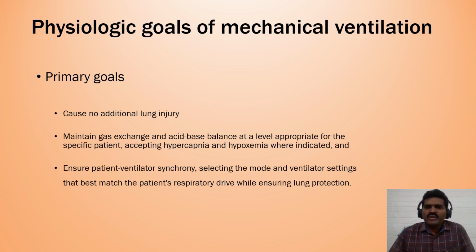This is a very important thing you need to do if you aim at reducing the work of breathing. You know, the work of breathing is a parameter that you want to take control over by intubating the patient and mechanically ventilating the patient.